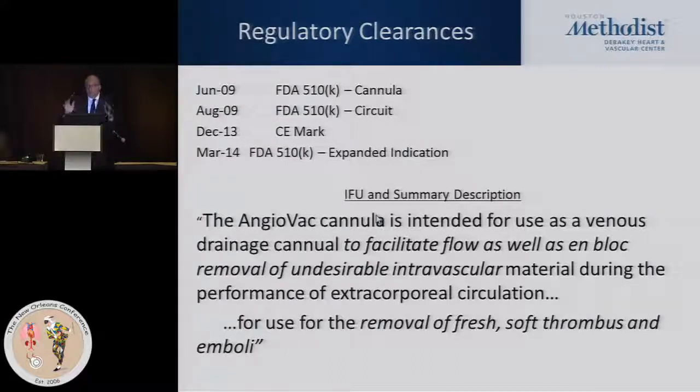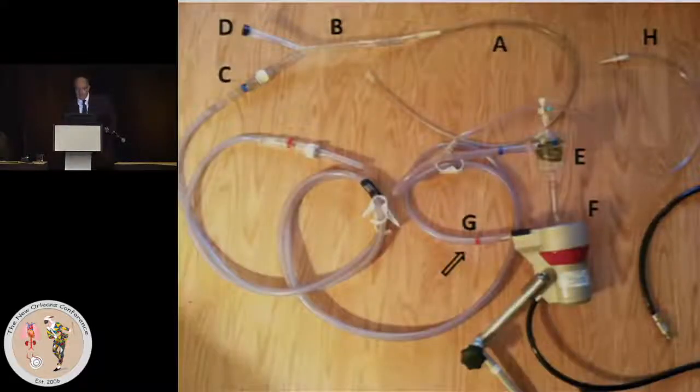So they have an FDA clearance for use as a venous drainage cannula, although it is pretty unheard of to use it for just that purpose, since it's a pretty expensive cannula. And it's also approved for use for the removal of fresh soft thrombi and emboli.